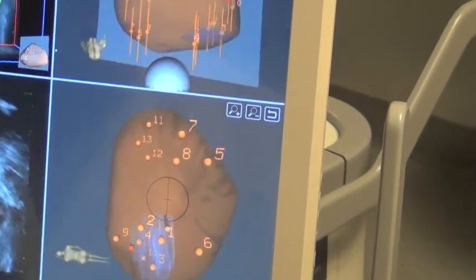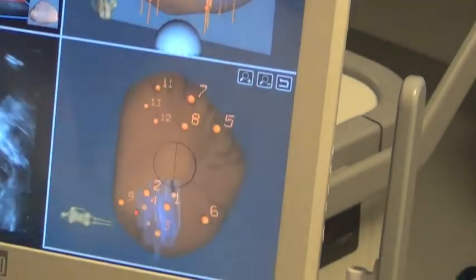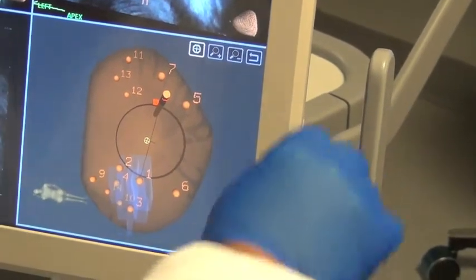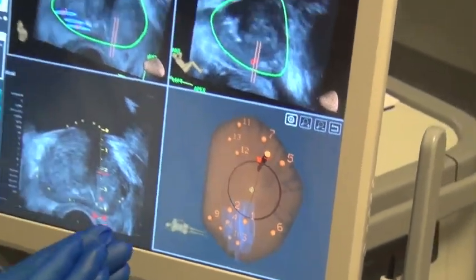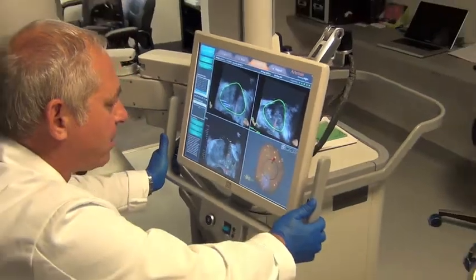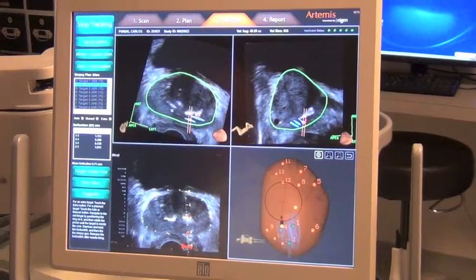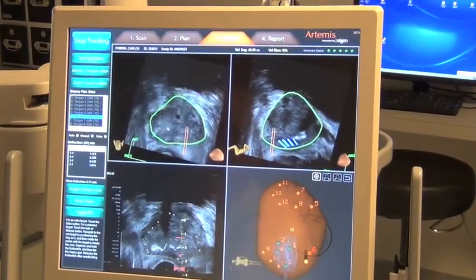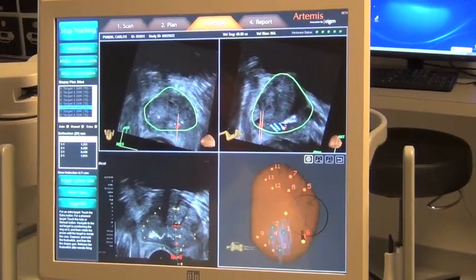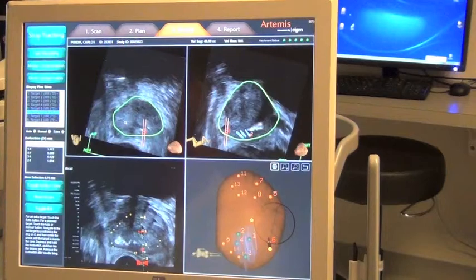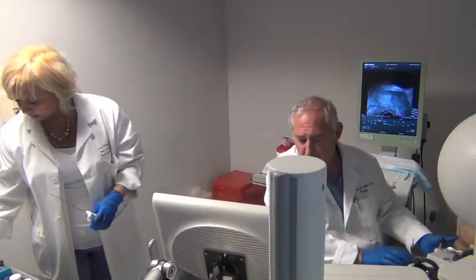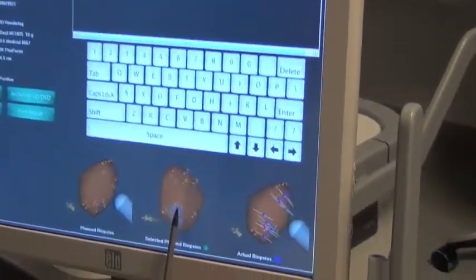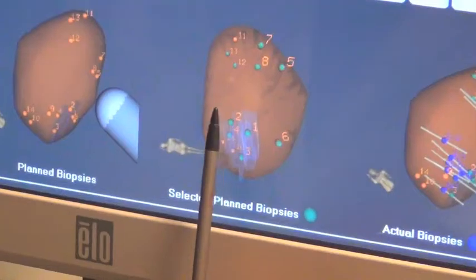Now I'm going to finish the fusion, and now we're going to develop our biopsy. In our biopsy mode, we'll simply align the Artemis device with these targets and we're ready to go. The area of interest is the left mid-MRI target — that's where the first biopsy is going to come from. Then we're going to go to the left lateral base, focused on the region of abnormality with the cores going right through the MRI regions of abnormality.